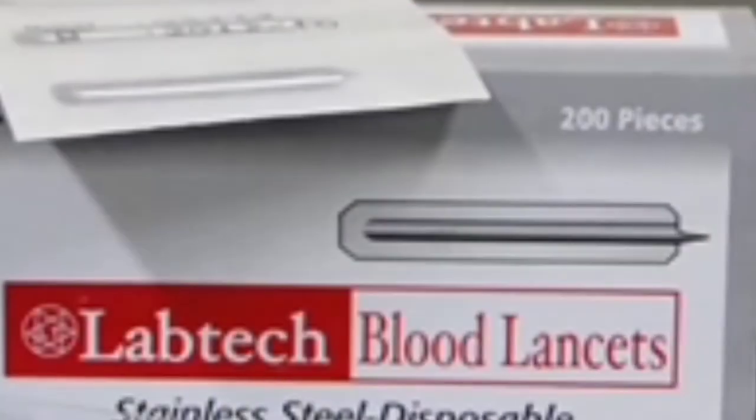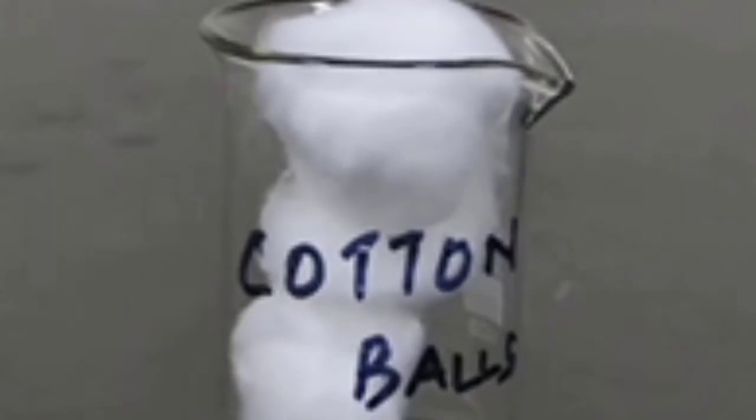To conduct the experiment, we require 3 monoclonal antibodies, anti-A, anti-B, and monoclonal D, kept in an icebox. Lancets, spirit, cotton balls, toothpick, and glass slide.